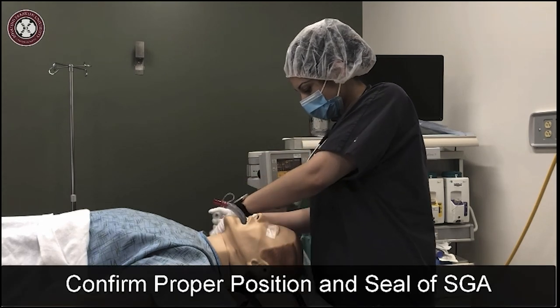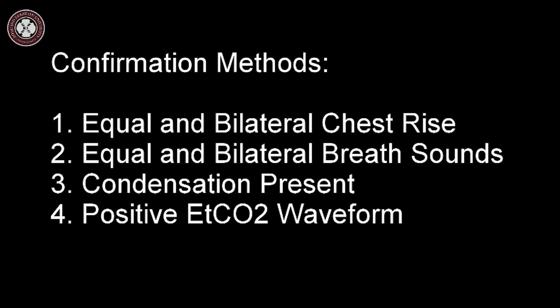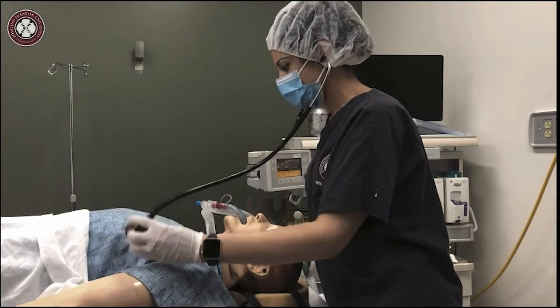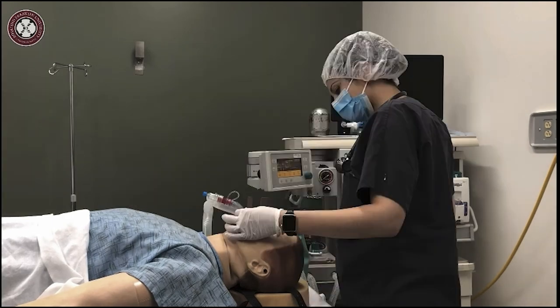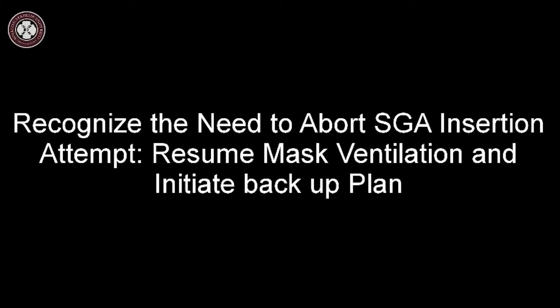Connect the SGA to the circuit and proceed to confirm proper seating and seal. Confirmation methods are listed here and must be verbalized. They include equal and bilateral chest movement and breath sounds, condensation, and adequate and consistent end-tidal CO2 tracing that's present for greater than 3 to 5 breaths. If placement wasn't successful, recognizing the need to forego the attempt and resume mask ventilation is also key.